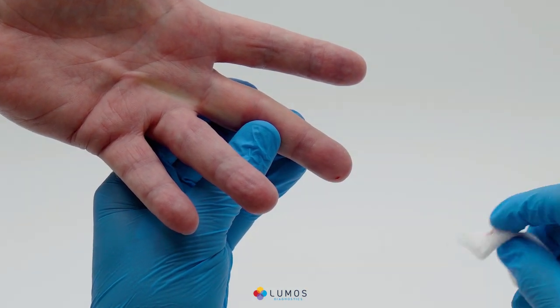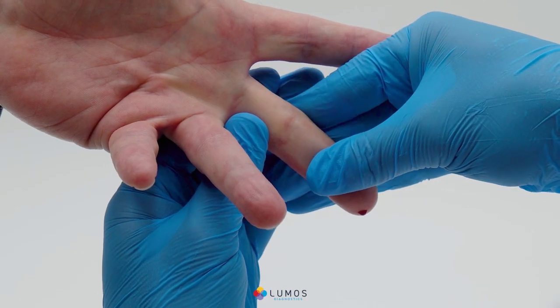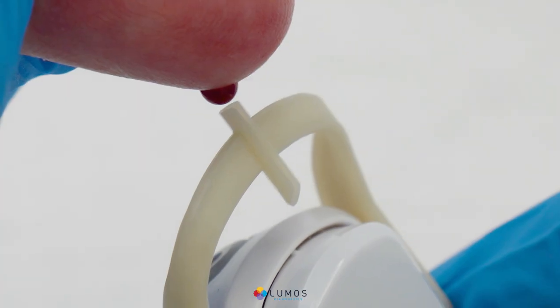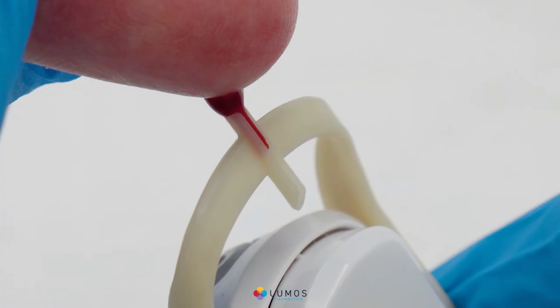Wipe away the first drop of blood. Massage the entire finger from base to tip to obtain a large drop of blood that hangs from the finger. Place the blood collection tube below the finger without touching it. Fill the blood collection tube completely by touching the drop of blood to the tip of the tube. Ensure it only touches the hanging drop and not the finger. If the drop does not completely fill the tube, massage the finger again and add more blood.